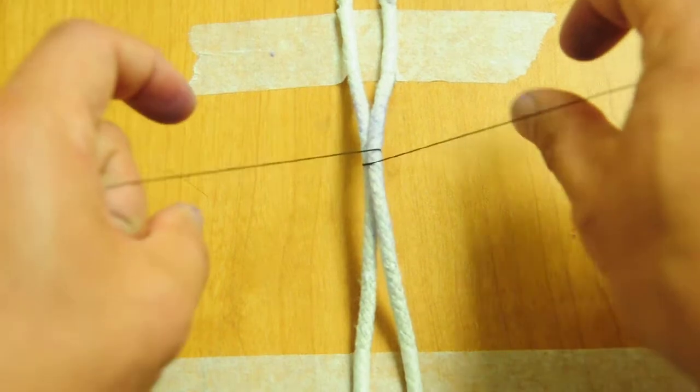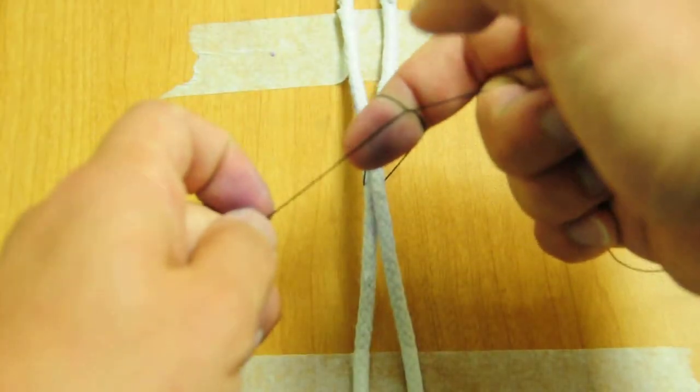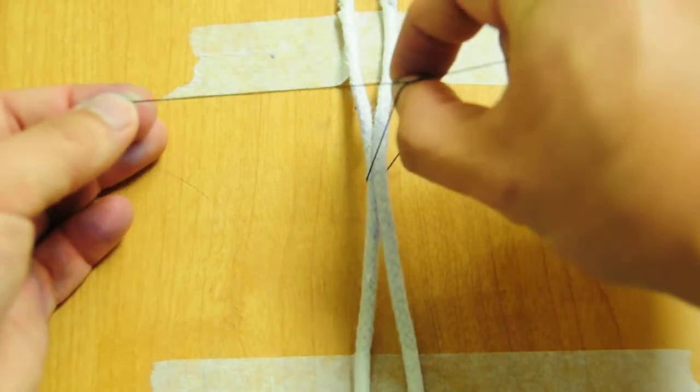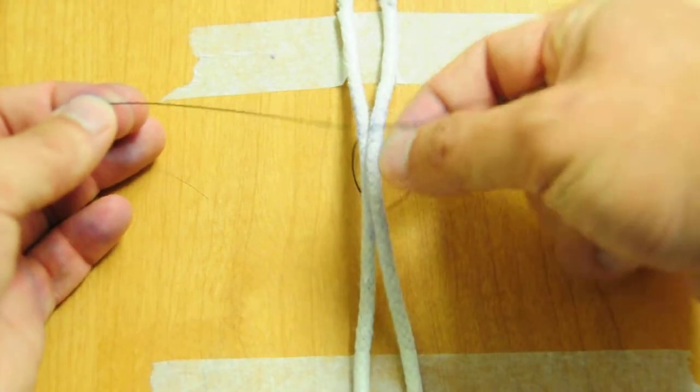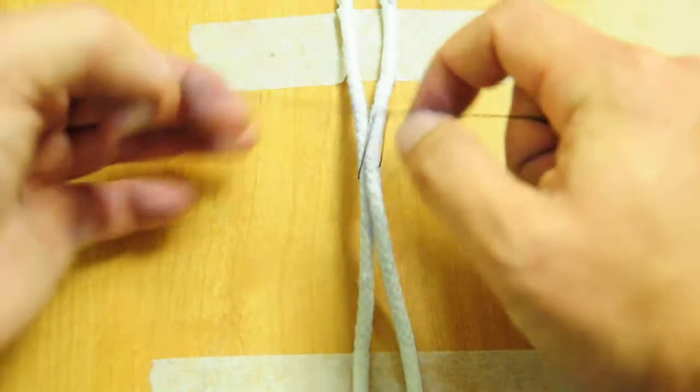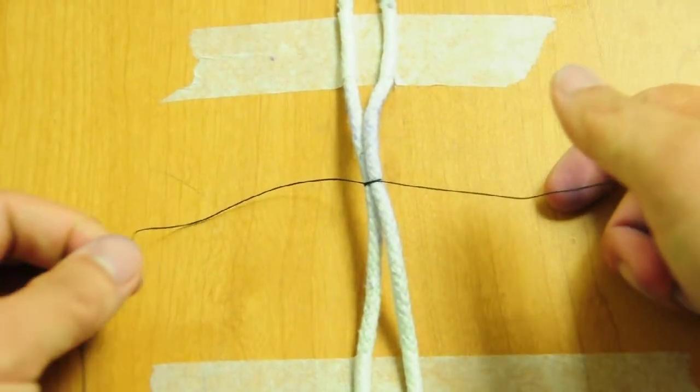So this is under, so I'm going to use my thumb. I'm going to push it under. Now I'm going to do two throws. I'm going to push the string through, take this free end, keep the thumb and finger together on the right hand, come back through for a second time, exactly like we did the first time. And this should cinch down and stay down.